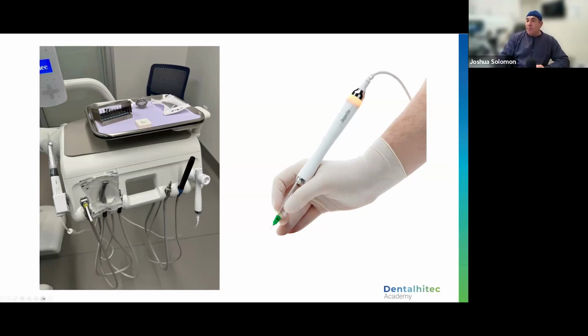One point I want to make here, you see how the Sleeper One is in the upward position. If you don't have a carpule of anesthetic in here, you can leave it like this. But you don't want to leave it in this position if you have a carpule of local anesthetic. It's possible that you could have some leakage in that carpule of local anesthetic, and it could wind up dripping down into your unit.